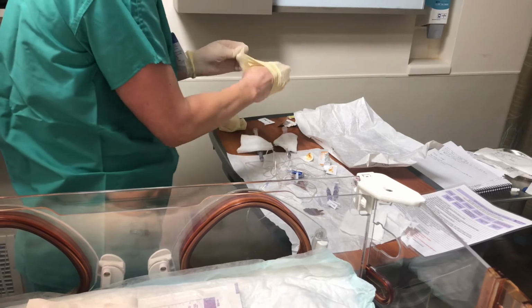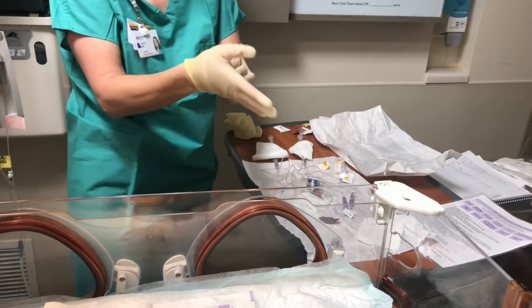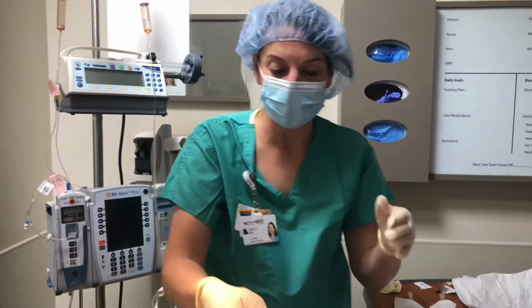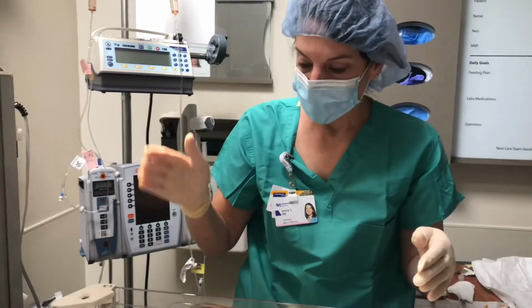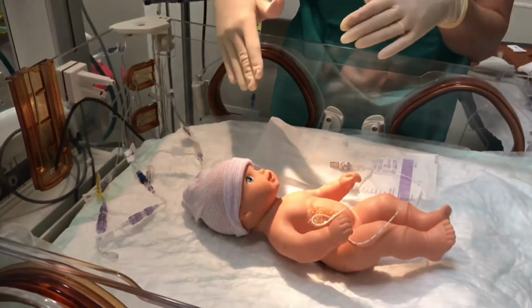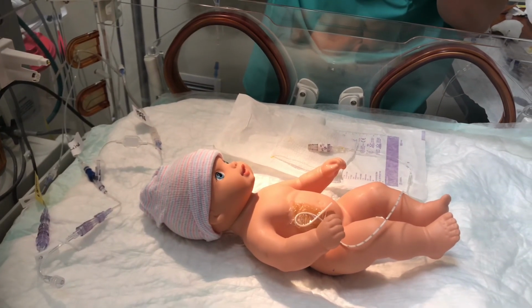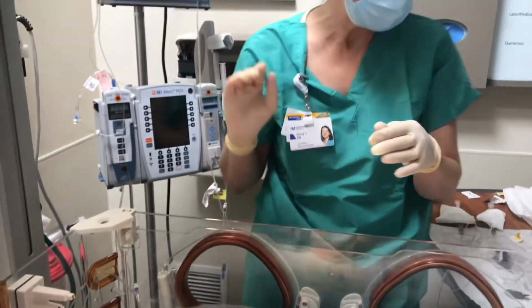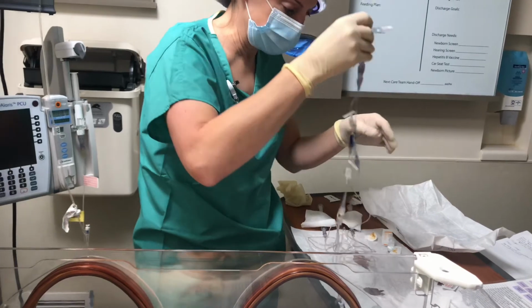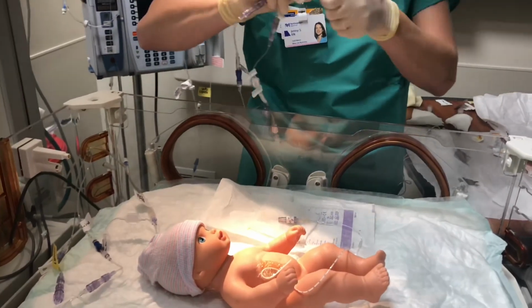And then you'll have your second RN with you to be able to then verify our fluids, our tubings, and do our tracing from the site of origin to the pump, making sure that we have all of our tubings labeled at our bifuse connector, and that we also have our medications and our IV tube change stickers all on our new fluids. Okay, at this time, I'm going to connect my tubing to my clave.